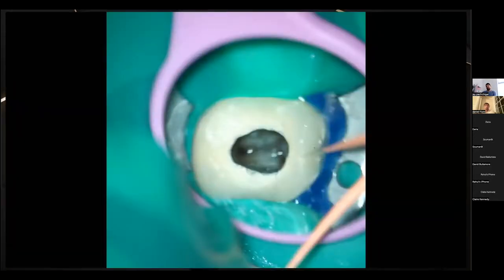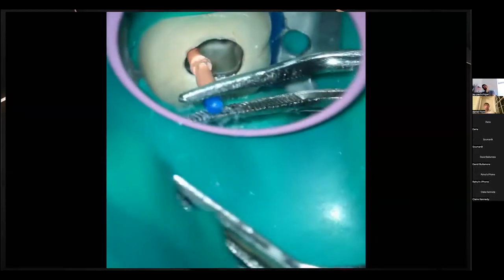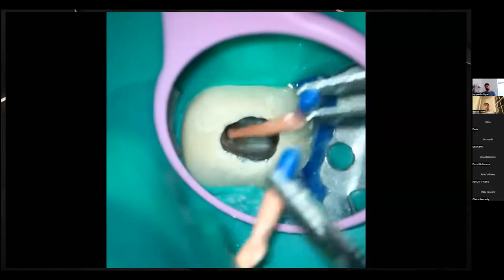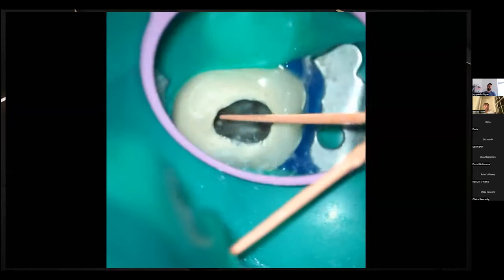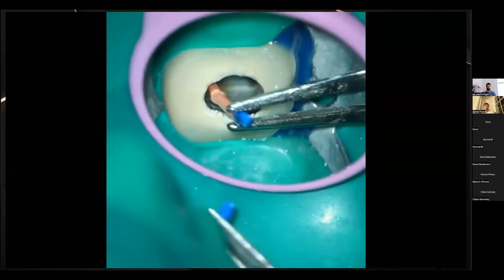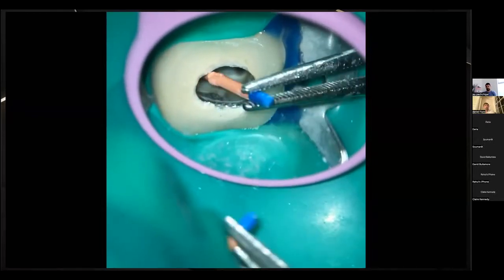So what that means is, this is a palatal canal. I've gone up to a 3006 on this canal. So I'm trying to now push the 3006 GP cone past the apex, and it's not getting anywhere. Sometimes what I do is get a 3004 cone and again try to get it past the apex. And again, we've got a good stop over here. So I know that there's going to be very minimal extrusion.